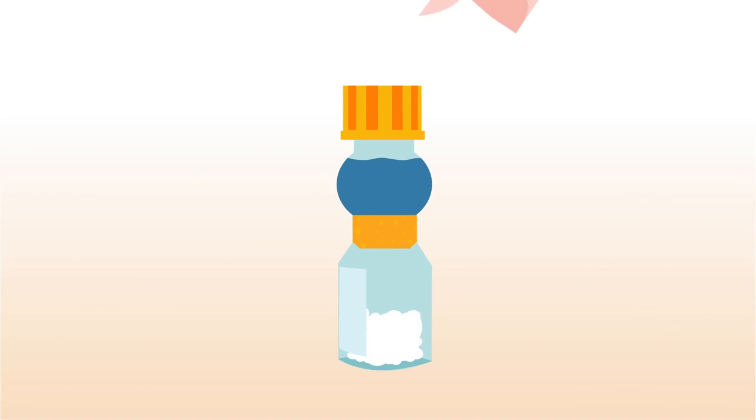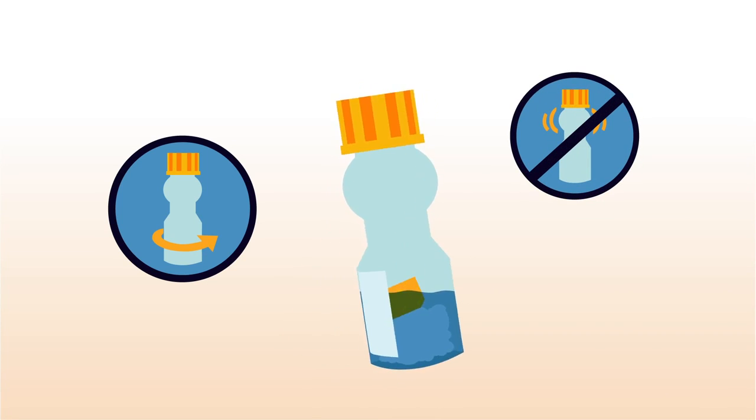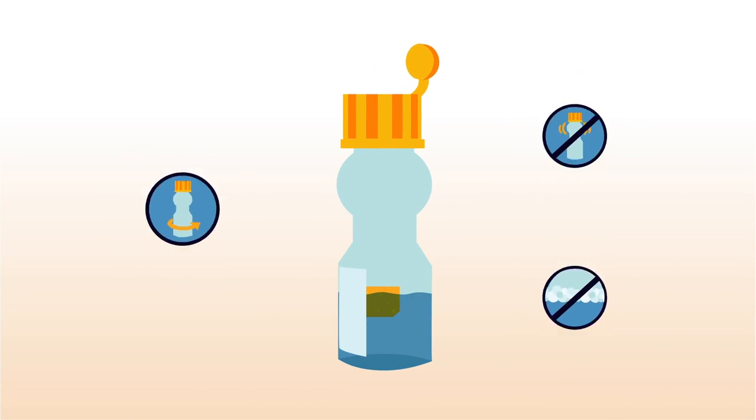Press the cap down hard until the cork shoots down. Mix the liquid and the powder gently. Don't make it foamy. Once the liquid is clear, it's ready.